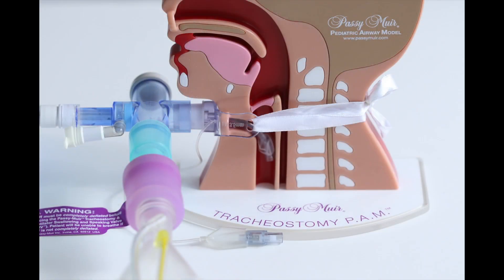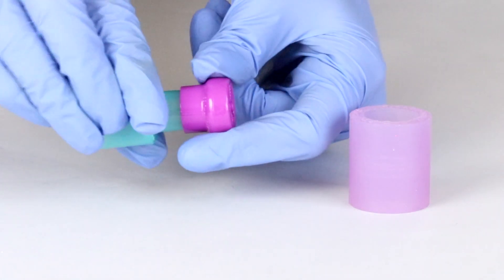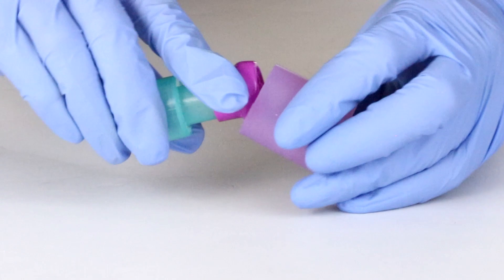When using the T-piece type in-line suction catheter, the PMV2001 purple valve can be secured in line by using the PMVAD1522 step-down adapter.